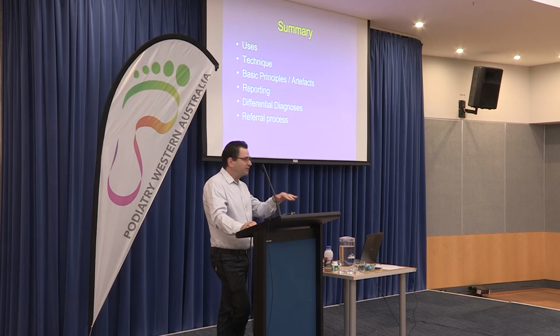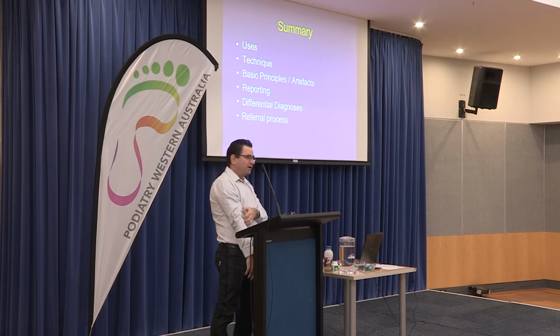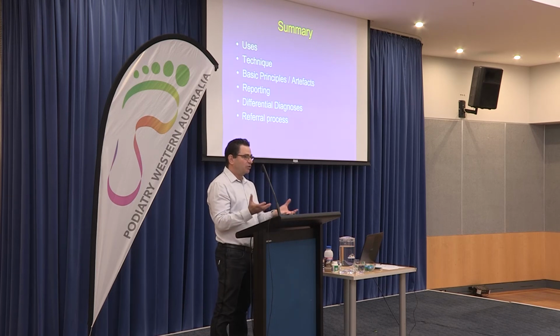And for things like peroneal subluxation or instability, you can actually test that in real life. But when someone's just lying flat on their back in the scanner, you don't see that nearly as much. There's a whole lot of things in other parts of the body, with dynamic problems, that you can do with ultrasound that you can't do with MR. So I view them definitely as tests that help each other rather than necessarily one is better than the other.